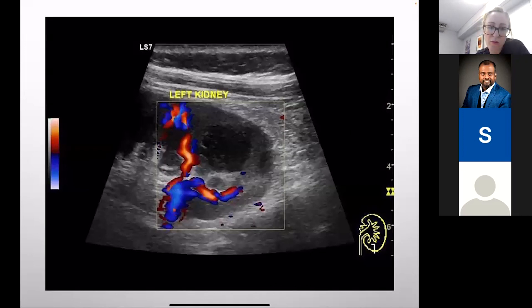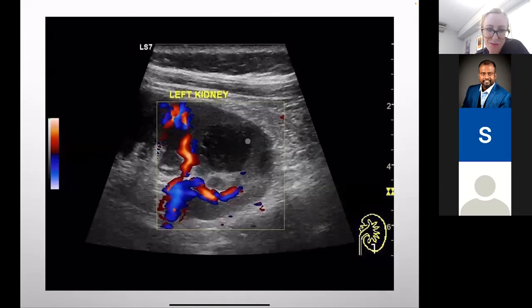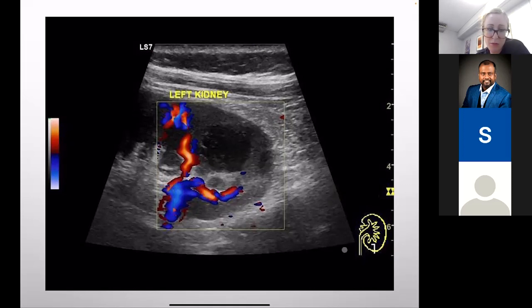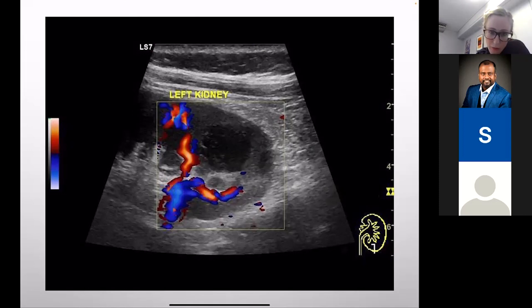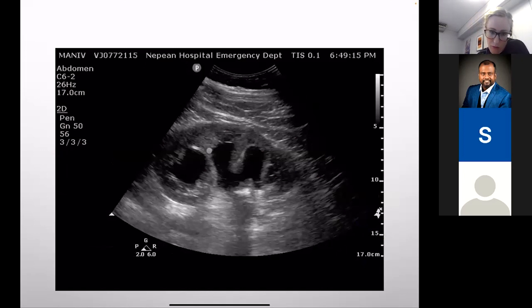Final image: there's a structure that could be a renal cyst, but it has some echogenicity within it. The differentials include abscess — and this is actually a case of renal abscess, because of the echogenicity and the fact that it's not a clean anechoic structure. The last image shows a cyst combined with hydronephrosis — in that image, it looks like it's not connected.